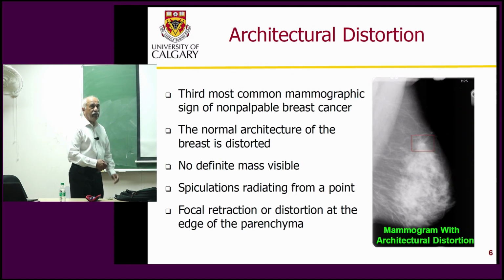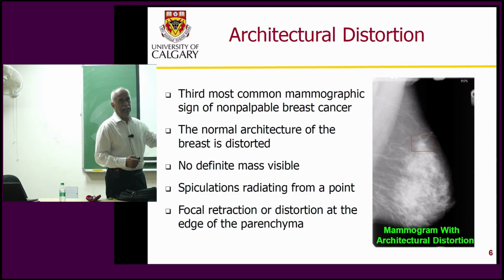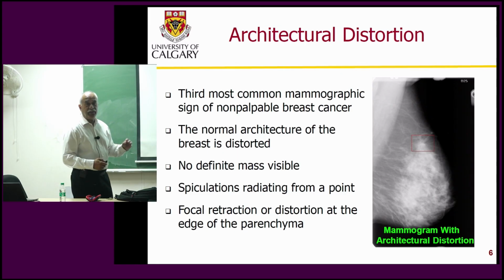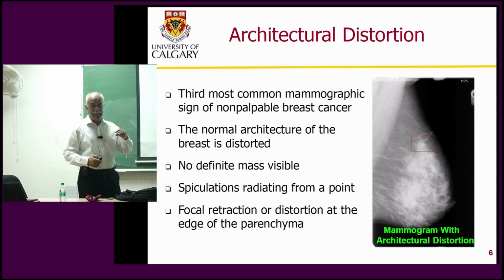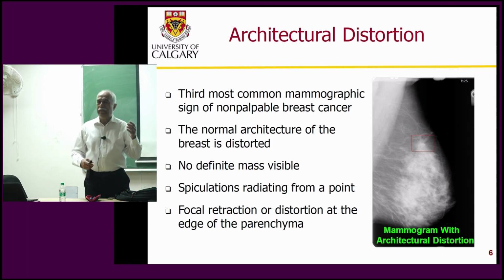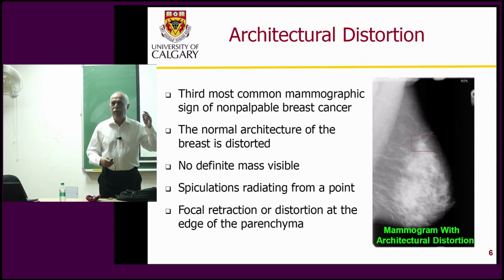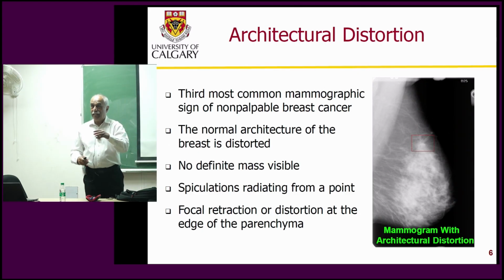Now, architectural distortion. This seminar and this project, which we started in the year 2000 or so approximately, is about architectural distortion. In our studies, as the field developed, and I attended a number of these conferences, methods were described to detect calcifications. There were thousands upon thousands of papers, and then masses. Masses are more difficult to detect.